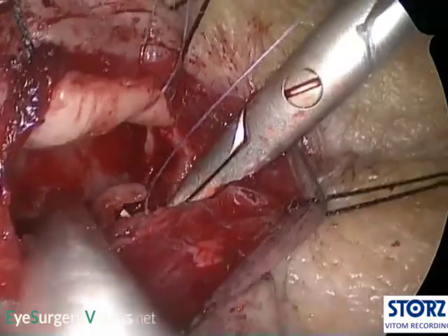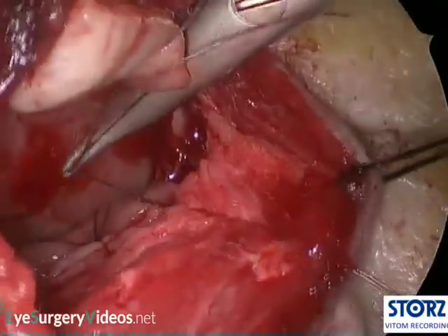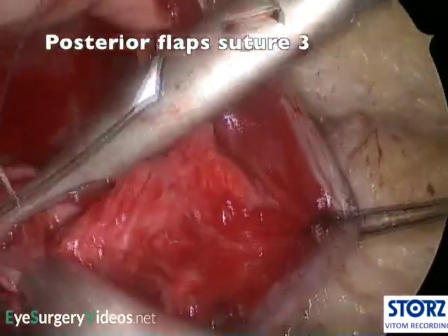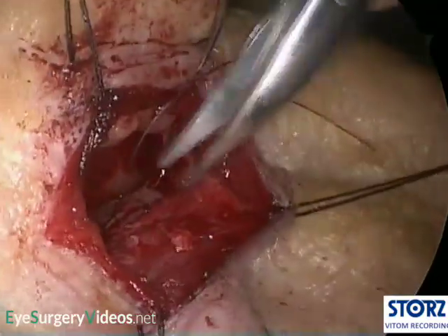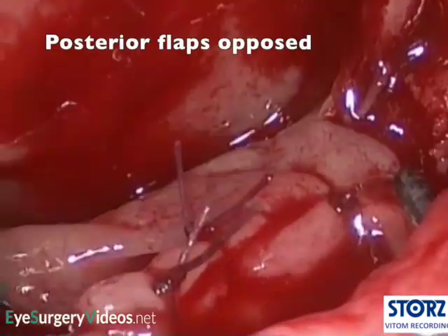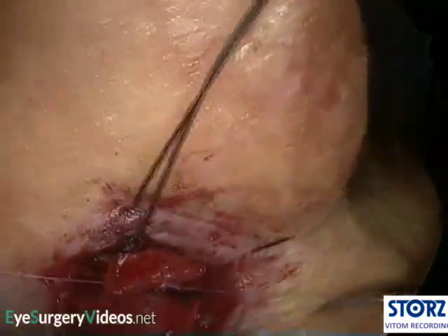Conflicting outcomes have been reported in studies of external DCR with and without posterior flap closure, although none have been adequately performed or powered to definitively answer this question. Intuitively, it seems prudent to oppose mucosa to mucosa in the hope of reducing fibrosis over the ostium, and therefore we suture both posterior and anterior flaps. A further 3 sutures are placed to join the anterior lacrimal sac flap to the anterior nasal mucosa flap.